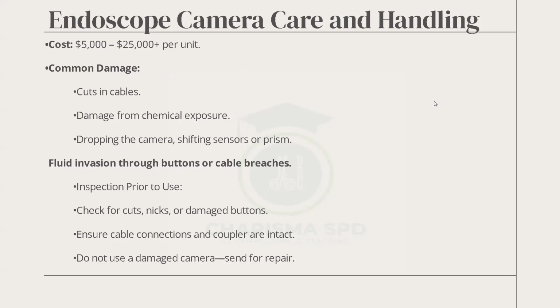Again, you have to handle it with care because of the cost involved and avoid having fluid entering them. Don't soak them for long hours. Okay, avoid dropping them on the floor. Once you drop a camera, if you drop your iPhone, you will not pick it up the same way. Okay, same thing as these devices that we deal with. Next slide.